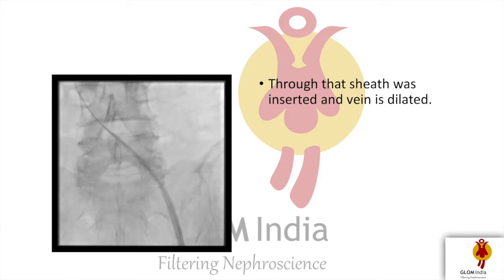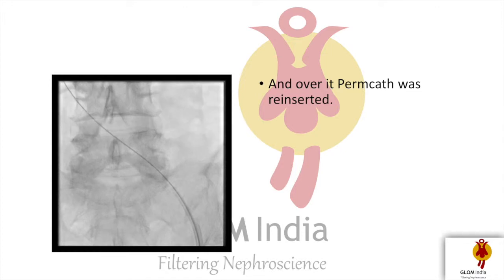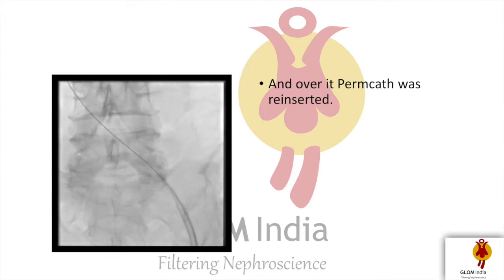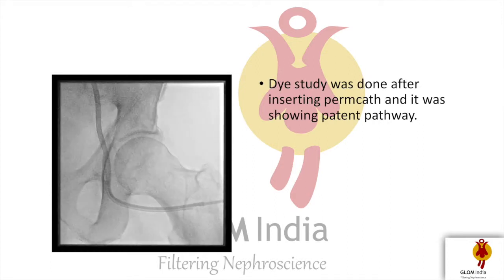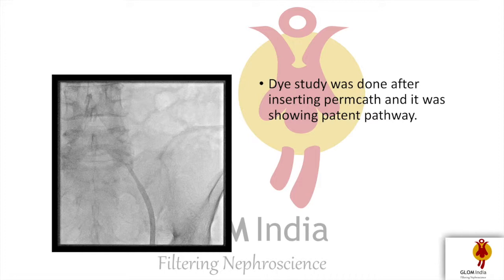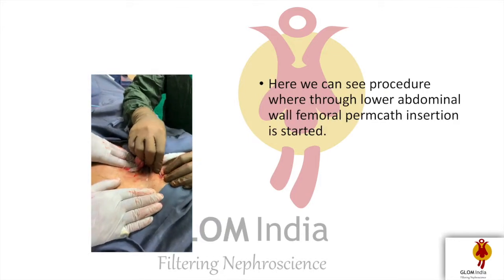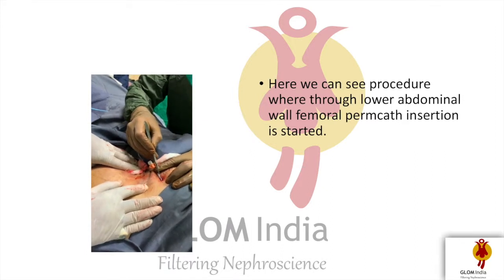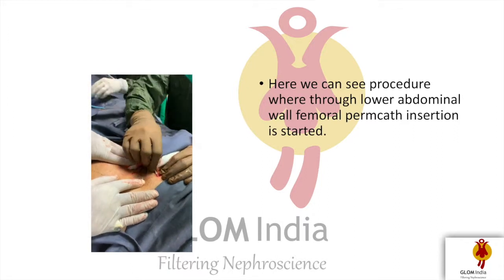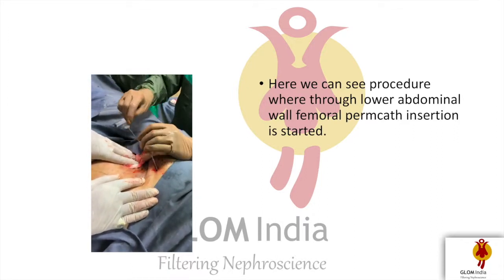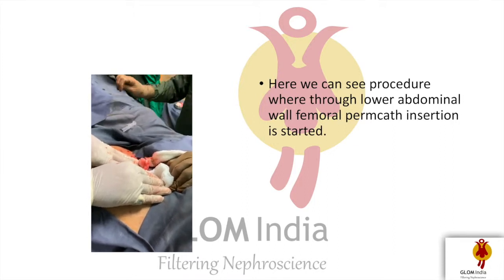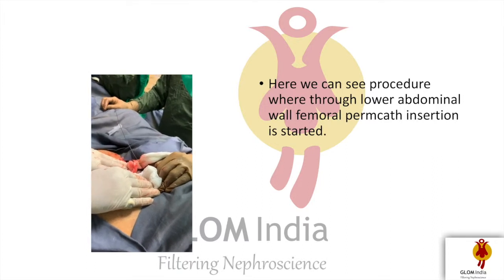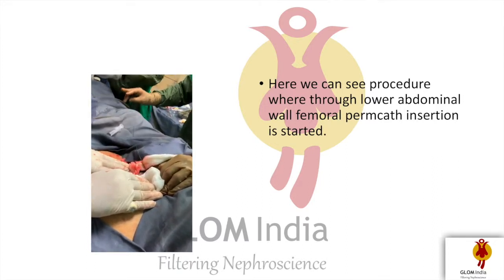Through that sheath the vein was dilated, and the tunneled catheter was reinserted. Here we can see the tip is now in the external iliac vein. The dye study from the newly inserted catheter through the abdominal wall showed a patent pathway. Here we can see the procedure where through the lower abdominal wall the femoral tunneled catheter insertion is started — the place through which the introducer needle was inserted and guide wire was positioned. Through that guide wire, a dilator is inserted to dilate the track for the femoral tunneled catheter.